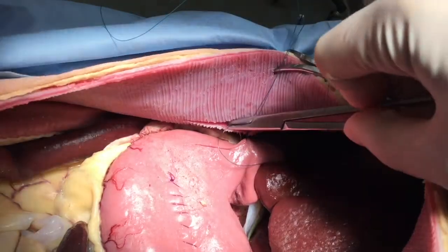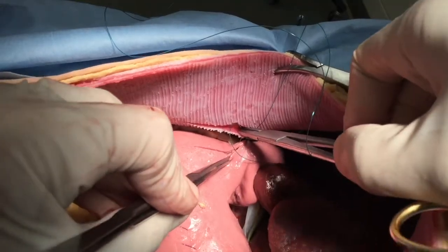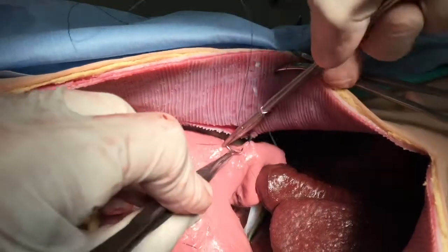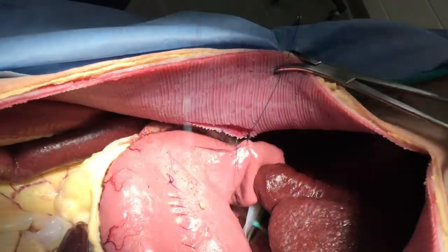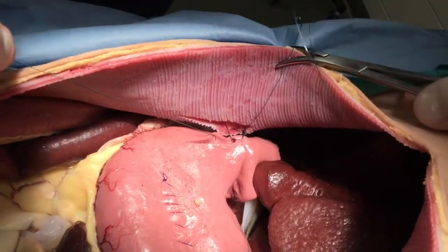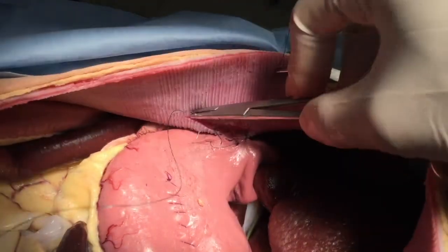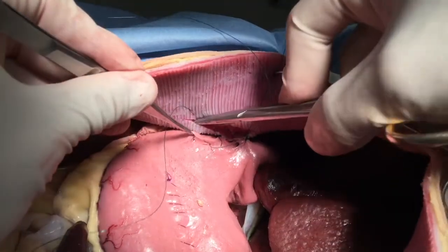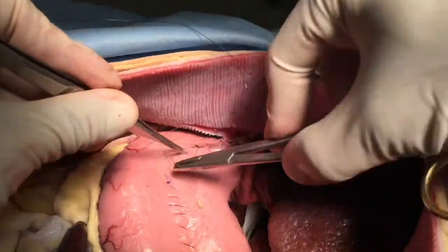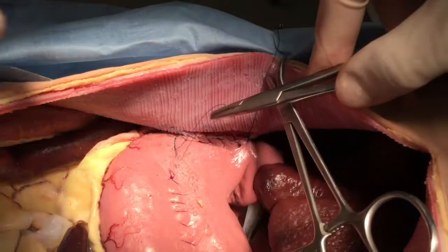Then a running continuous suture pattern is made. Note that the needle is actually entering and exiting through the incisions that you have made. It is helpful to have an assistant maintain some mild degree of tension on the line as you are passing each bite, in order to maintain that apposition and suitable tension between the stomach and the transversus.